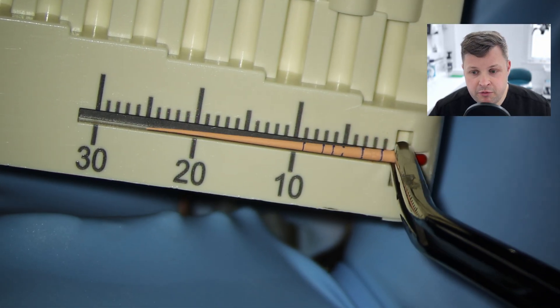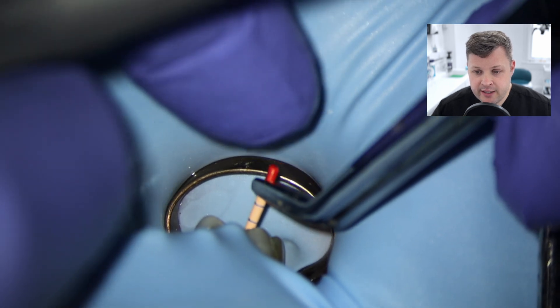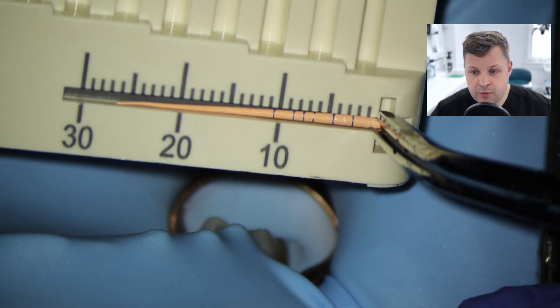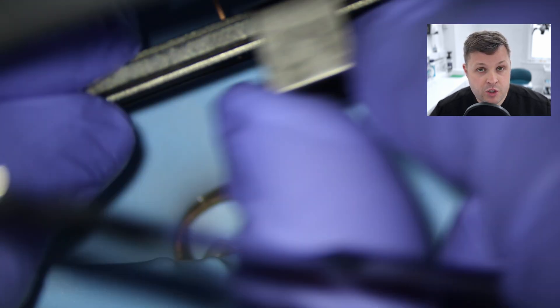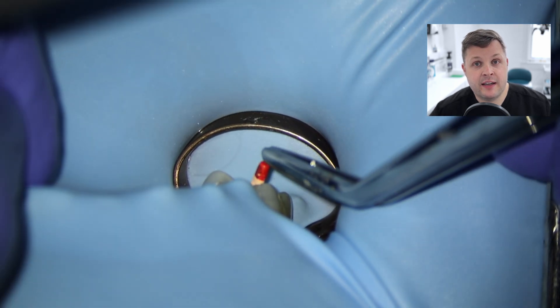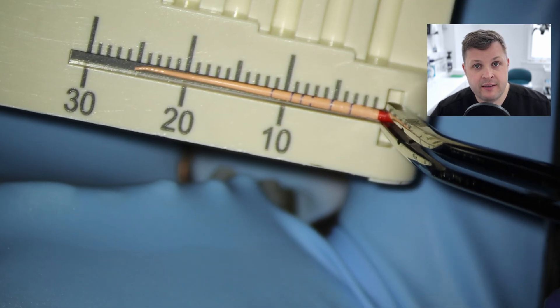The first cone we're going to fit is the palatal, and we're going to fit these narrow tapered diameter files up to the point where it's been shaped, which is 25 millimeters. As I gently push this GP cone to length, it pushes past the reference points. When I pull this out and measure it, I know that the GP cone is longer than the shape we've shaped to. So I'm going to use this cutter here just to cut the cone to 30 - it was 25 and now it's 30. As I push this cone gently but firmly to length, I feel for a little bit of tug-back, then pull it out and measure it. The GP cone is at the correct length: 25 millimeters.